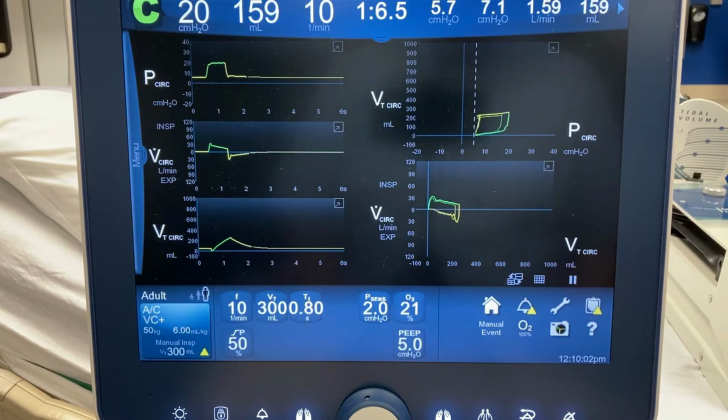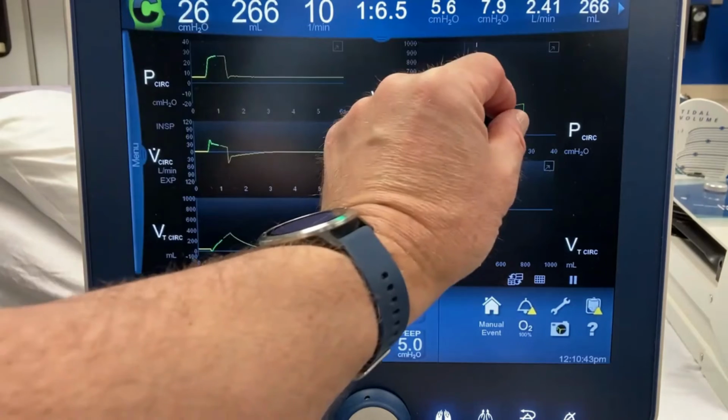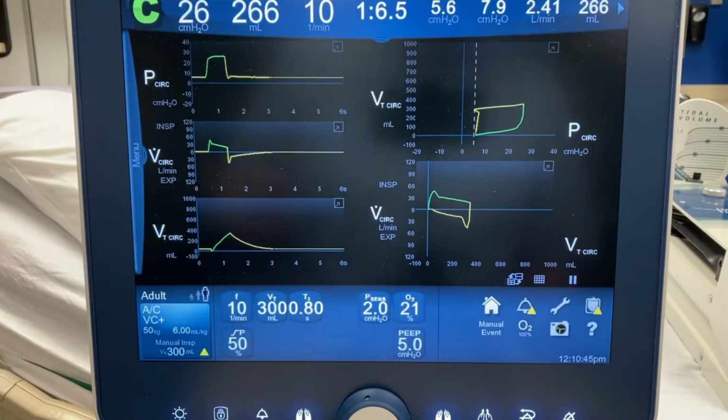Oh, look at our pressure volume loop. Remember how thin it was before? That's airway resistance. So we can say that the fatter this loop, the more resistance there is. You can see that from across the room. Then you can start thinking about causes of resistance. Some common ones would be bronchospasm, airway inflammation, mucus in the airway, maybe they need suctioned.